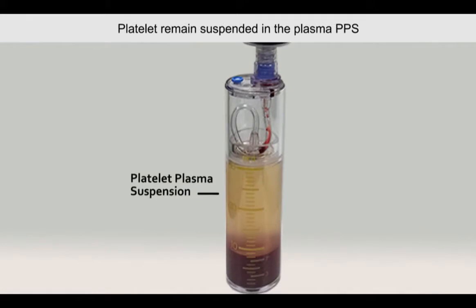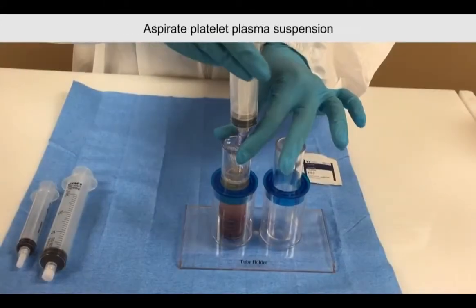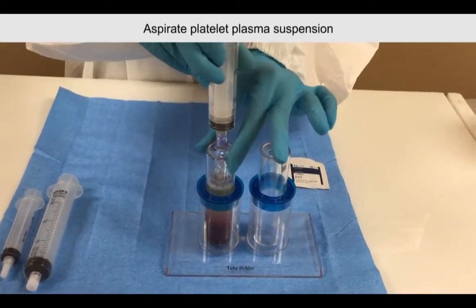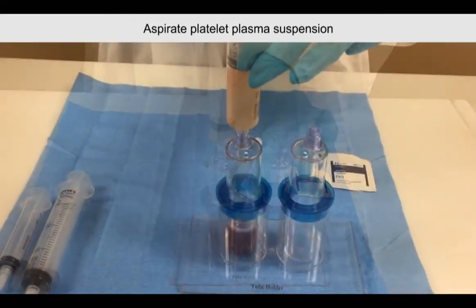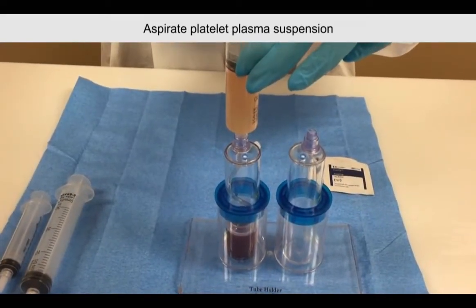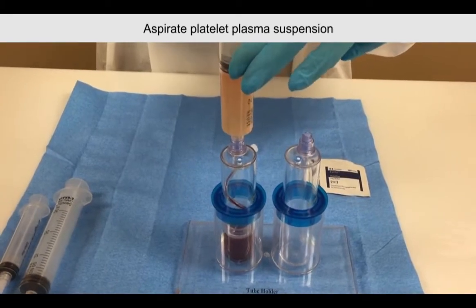When completed, the platelets will remain suspended in the plasma — this is called the platelet plasma suspension. Aspirate only the platelet plasma suspension into the 30ml syringe. It's normal to get small amounts of red blood cells during aspiration.